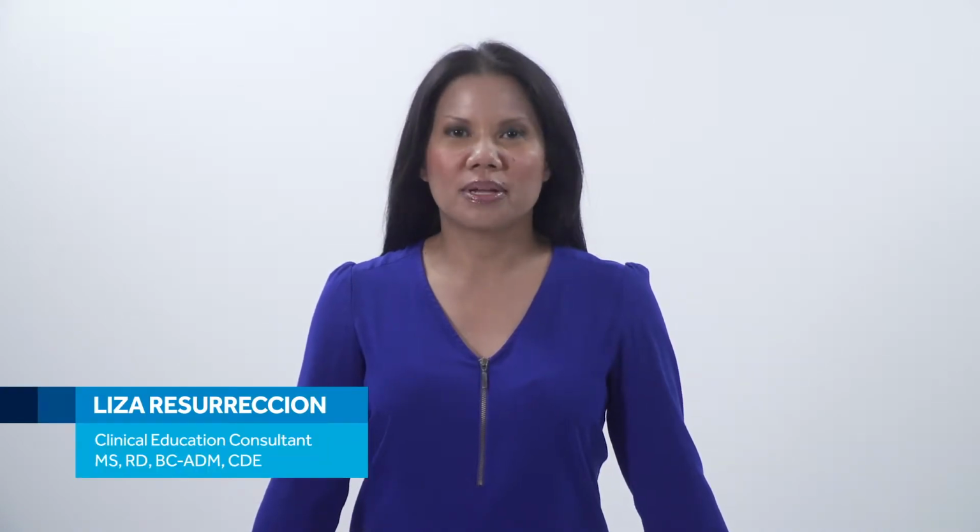Welcome back to part 1 of the Guardian Connect system walkthrough. In this video, we'll be discussing trends.